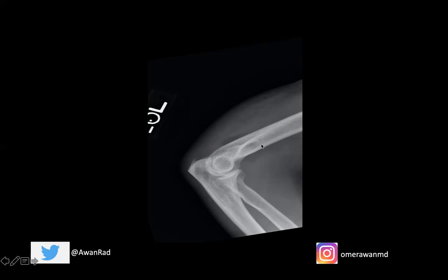This presence alone is not pathognomonic for a fracture. However, in the setting of trauma — let's say the patient fell — then this would be pathognomonic for a fracture. There are other causes of a joint effusion in the elbow: for example, infection and septic arthritis can result in a joint effusion, as can inflammatory arthropathies like rheumatoid arthritis and gout. But in the setting of trauma, if the patient has fallen, you should suspect a fracture, whether or not you can see it.